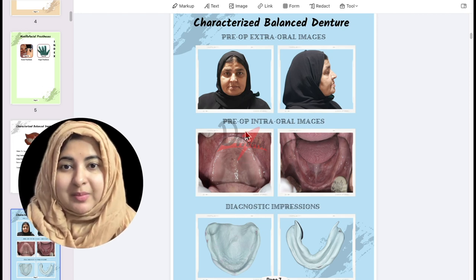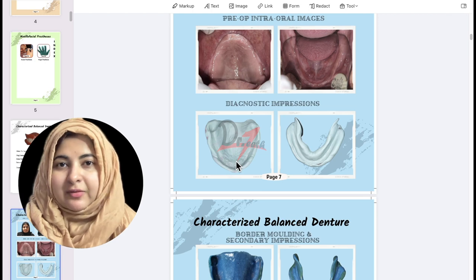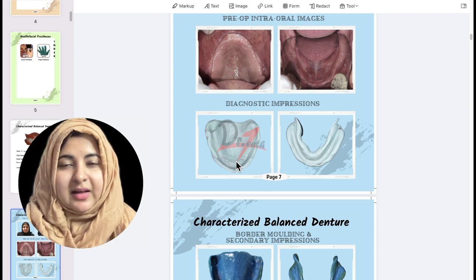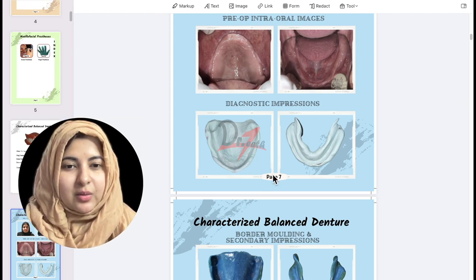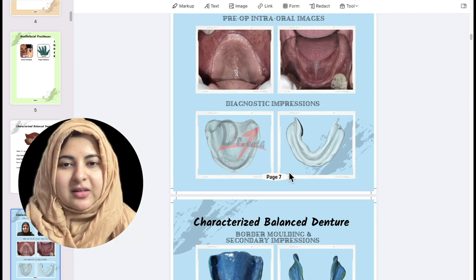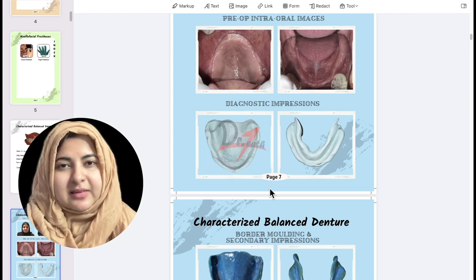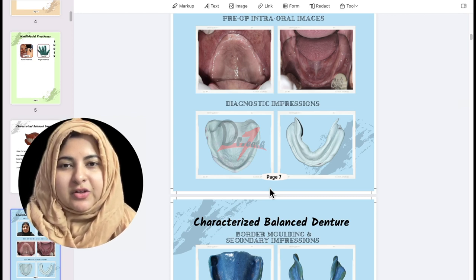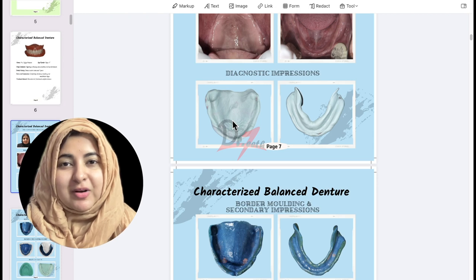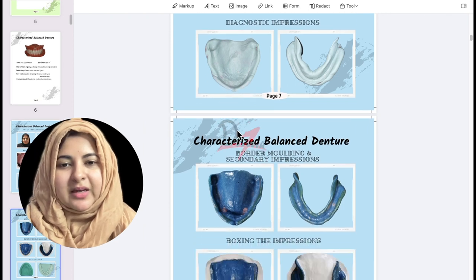We start with pre-op extra oral and intraoral images, then make the diagnostic impression. Diagnostic and primary impressions can be different: after making the diagnostic cast, if you realize pre-prosthetic surgeries are required — tori, retained roots, etc. — then after surgery another impression is made, which is the primary impression. In this case, no pre-prosthetic adjustments were needed, so the same diagnostic cast was used as the primary cast.